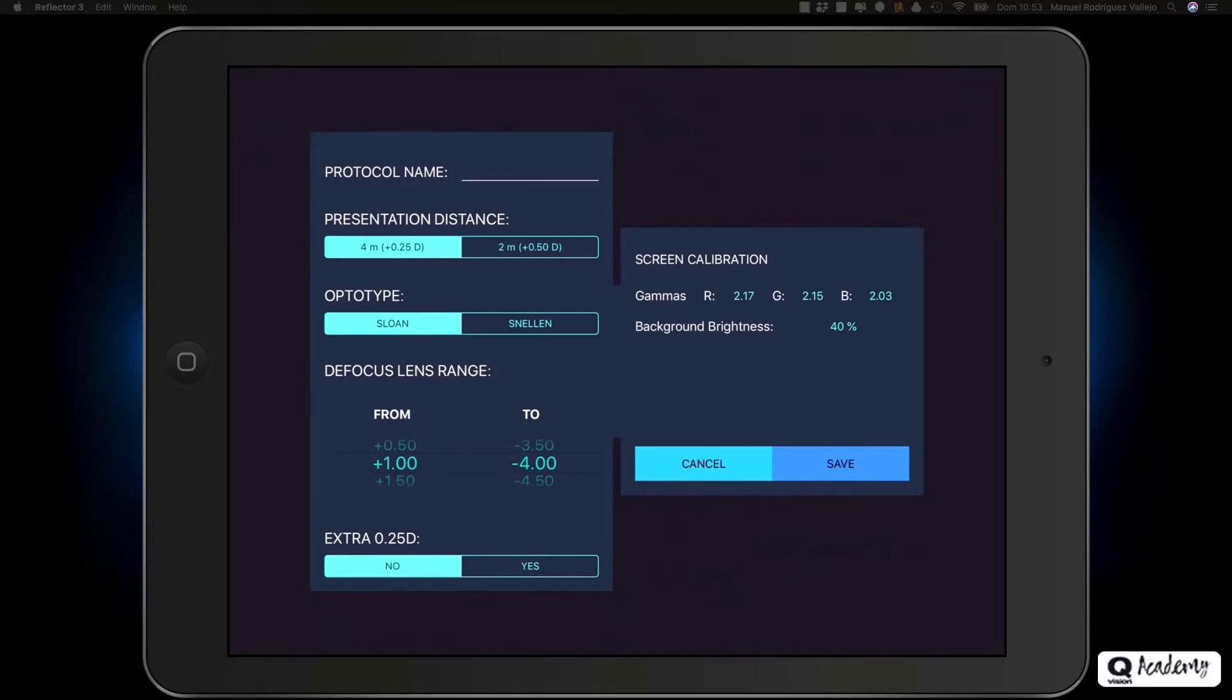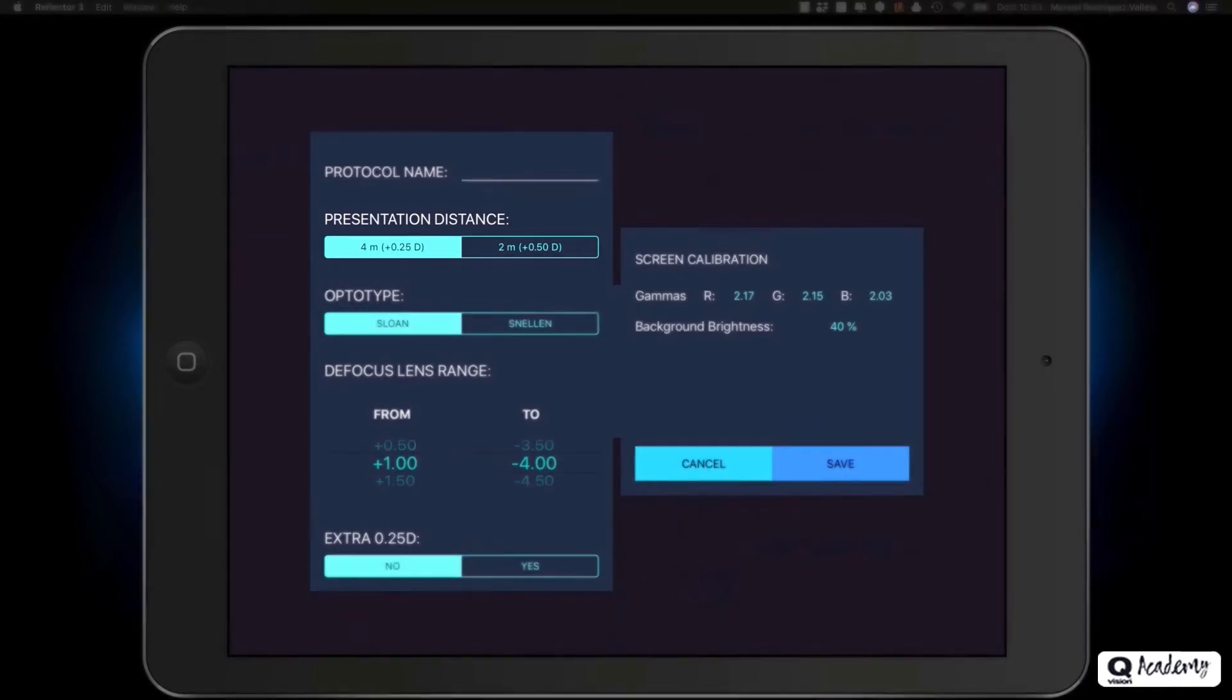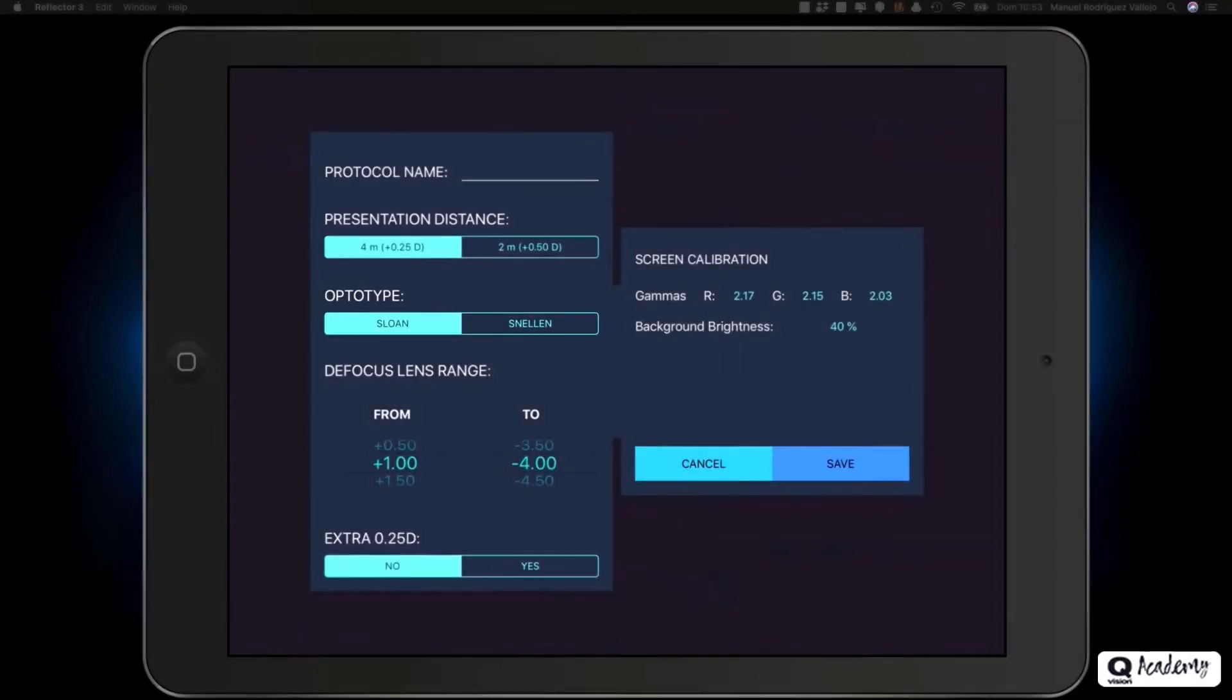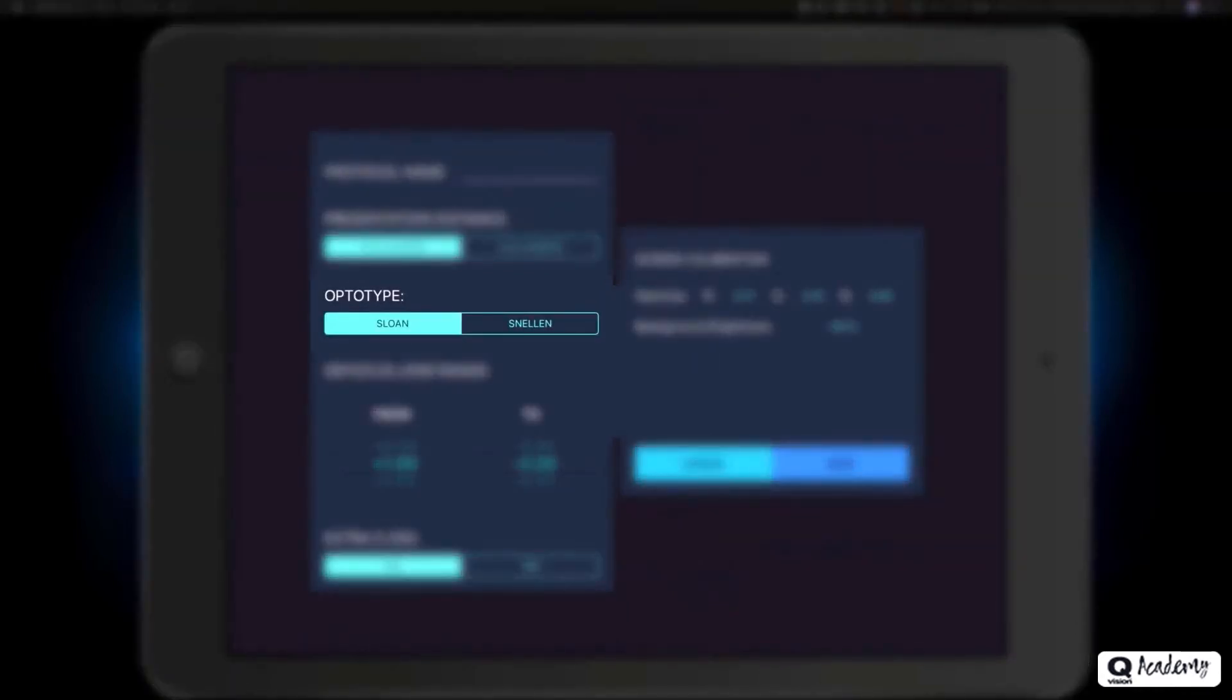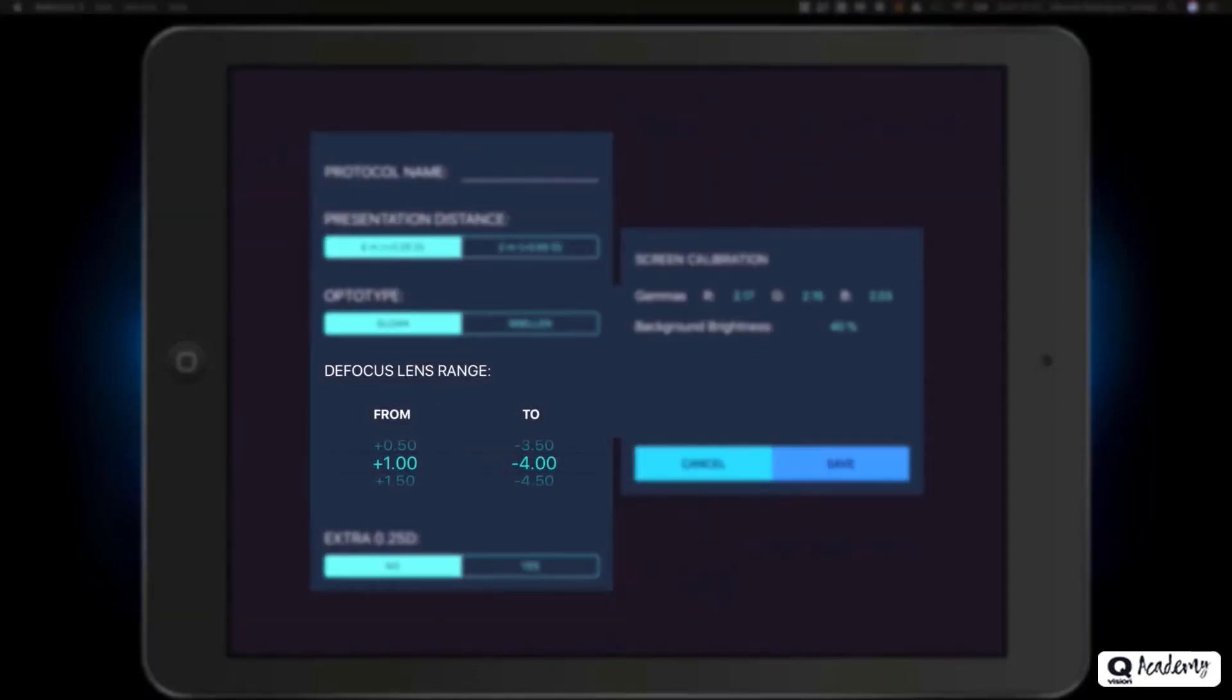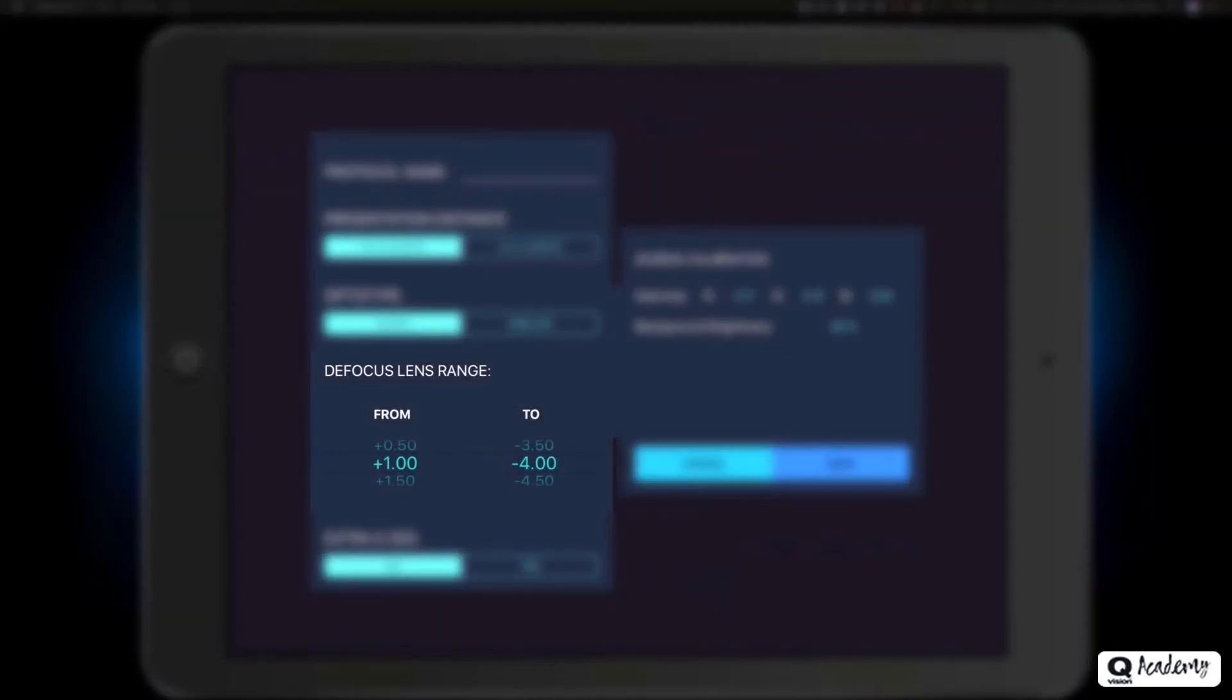In this window, you have the configuration of the protocol. Think carefully about the measurement conditions before creating the protocol, as these cannot be changed once the protocol has been created. The configurable options of the protocol are presentation distance, Sloan or Snellen optotype and defocus range.